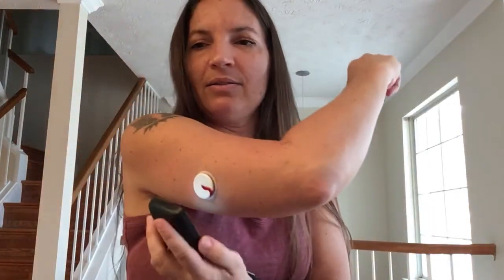Okay, so that's in. So now we'll just see a simple scan. This is a 1 hour warm up, so I do not in any way expect that it would be ready to give me a value. But the question is, what happens when I scan it before this one has ended? Okay, so I scan the old one. I'm still at 120, so I made it 6 minutes without screwing up. And then what we'll do is I go back to the menu, hit check glucose again, and I scan this.